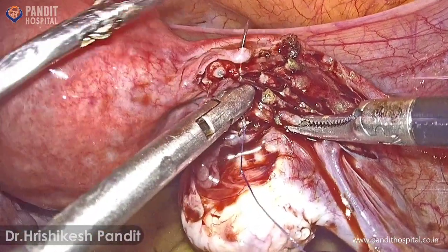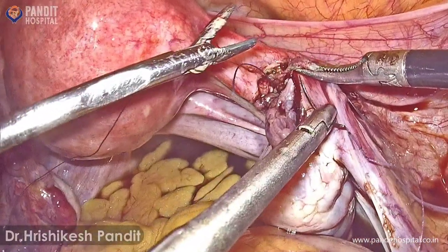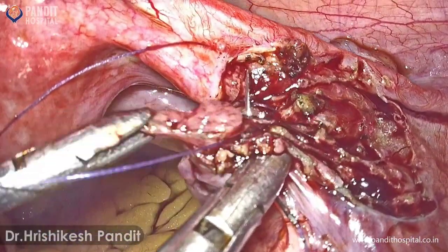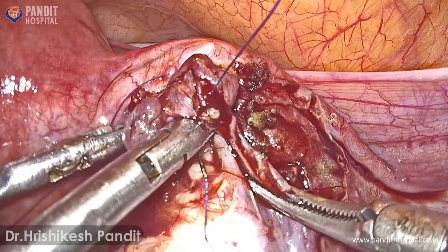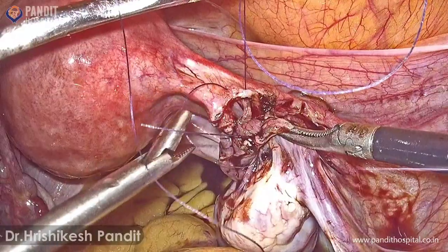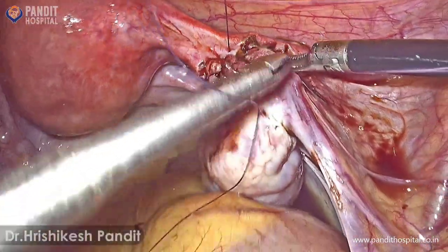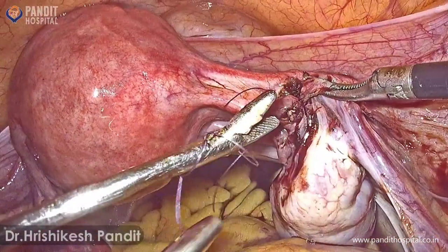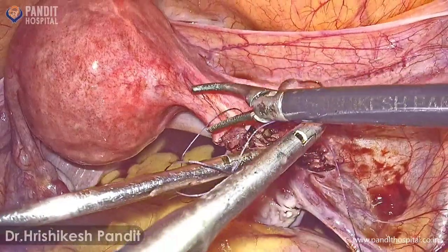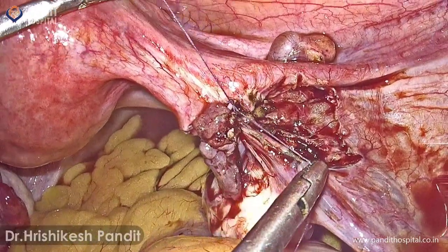These stay sutures work to bring both ends together. I am going to put a figure-of-8 stitch at this point, and we are going to use 5-0 Vicryl for this. This will bring both ends together, which will help us when taking the bite from the mucosal layer at 6 o'clock and 12 o'clock.